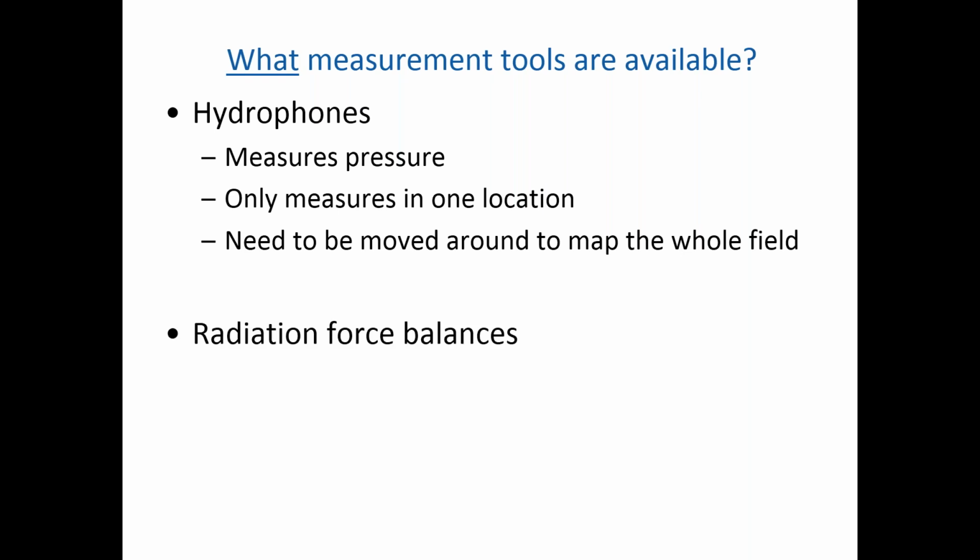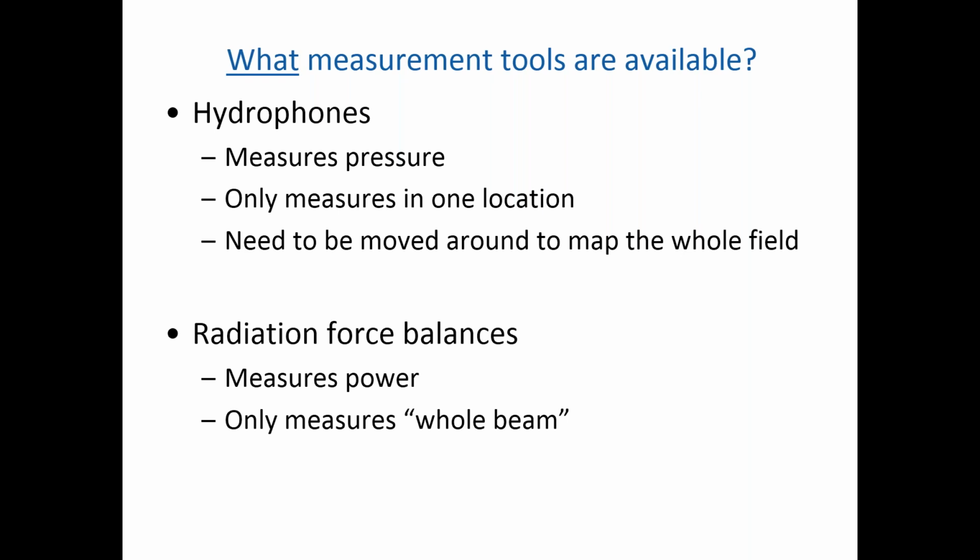We also have radiation force balances. Now, these are devices that measure power directly, but they only measure the whole beam. There's no opportunity for spot measurements with a radiation force balance. I'm now going to go on and talk about those two different measurement tools in a little more detail.